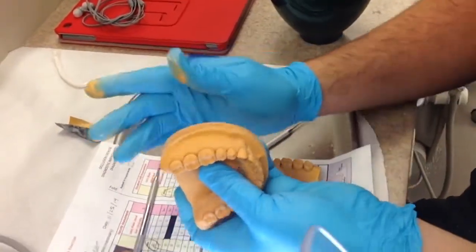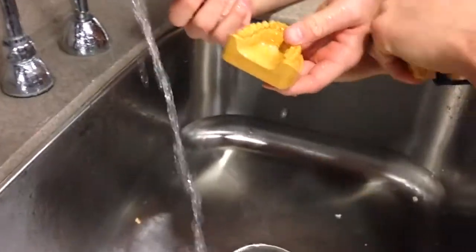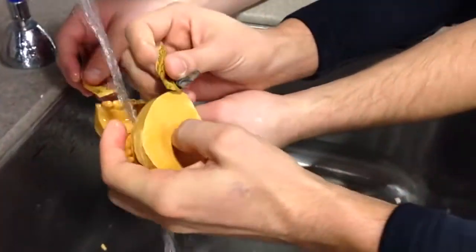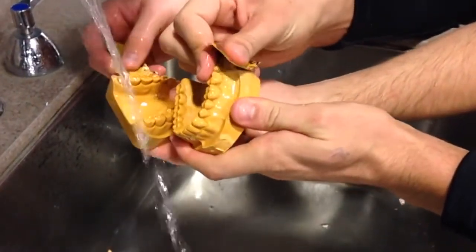You may see a few more holes pop up, so fill these in again. Once all your holes are filled and dried, you can sand the cast with some wet sandpaper. Make sure you do this under water — this will make it very, very smooth.